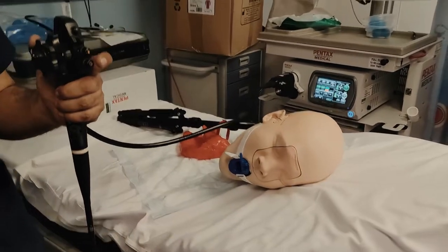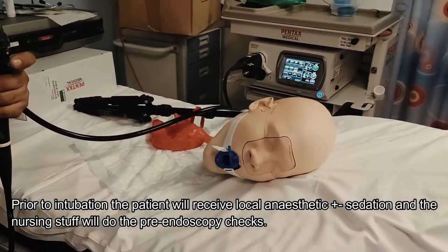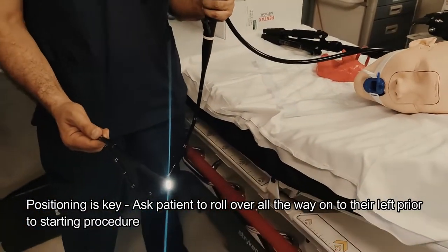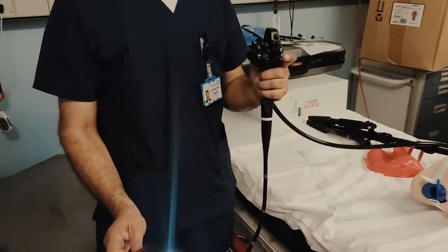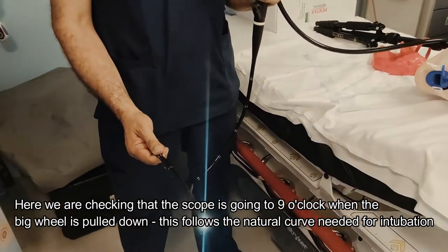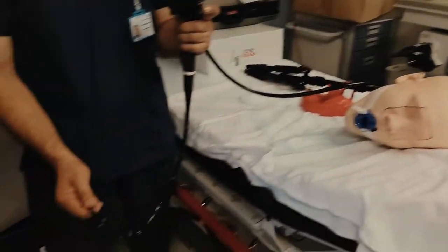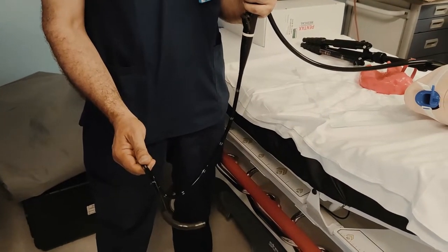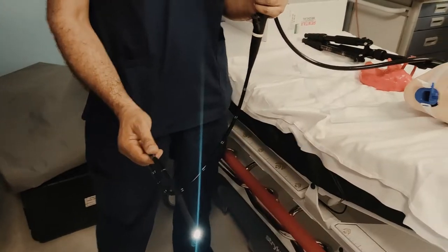When we are doing esophageal intubation, which is the first aspect, we have the patient in the left lateral position with a mouth guard in. The important thing that Dr. Havari will do is orientate himself so that he knows exactly what will happen when he presses down on the wheel. Dr. Havari wants the scope to go at nine o'clock, which will be the natural direction that the esophagus will go, parallel to the mouth. Dr. Havari is doing his golf swing where he confirms it's going at nine o'clock — this is an important step, and something to do every single time before an endoscopy.